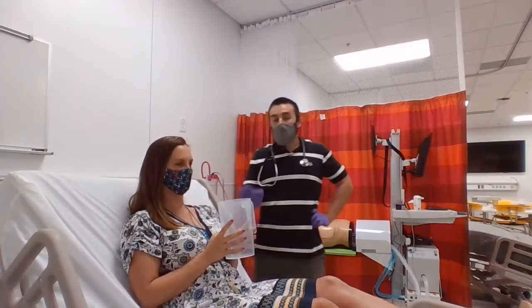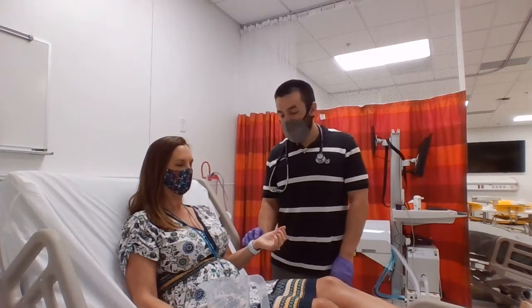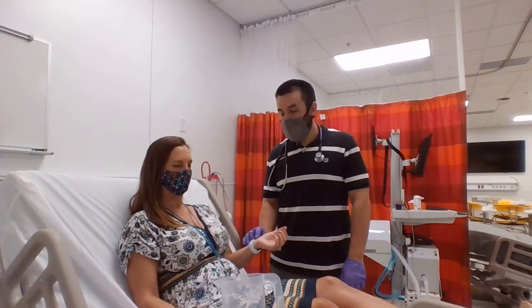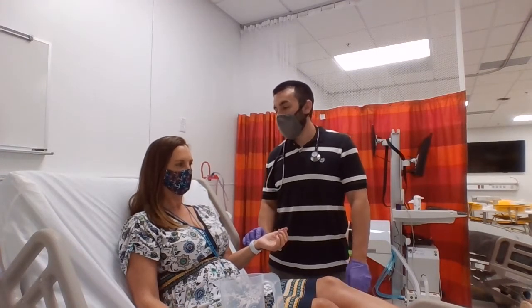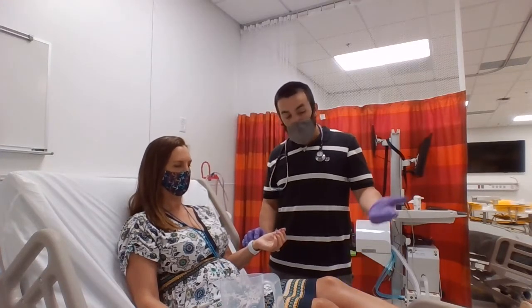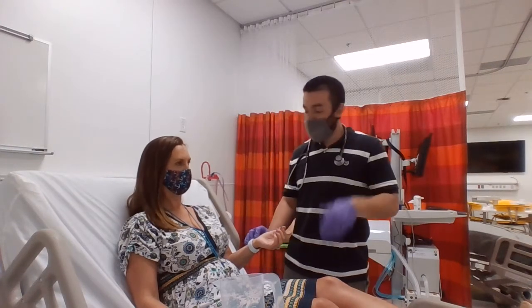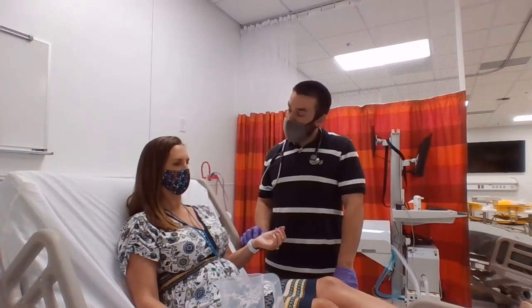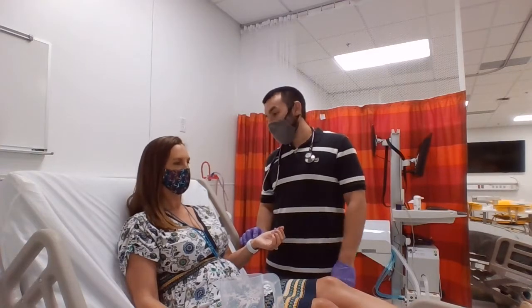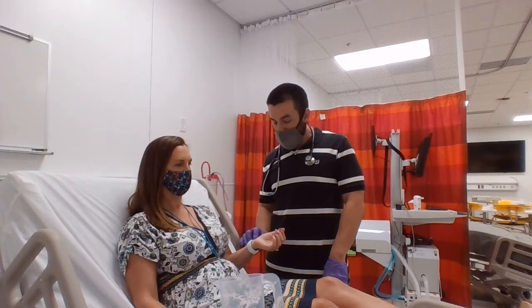All right. I just want to check your vital signs one last time since the first time you did. I doubt anything changed. You probably won't feel effects of that one right away, but you said you're feeling a little bit better with that last albuterol. This one would be done twice daily. You were doing the albuterol in between, to get you feeling better on a consistent basis, and hopefully this Advair is going to help keep your lungs opened up and prevent you from having some of those symptoms.